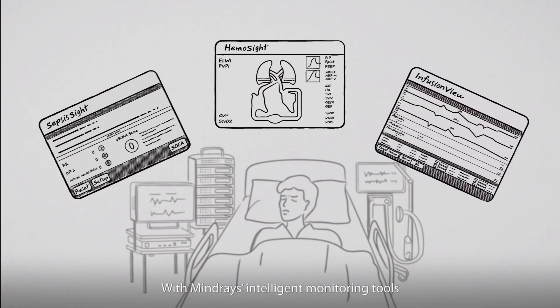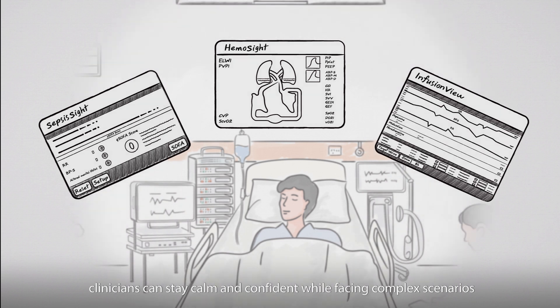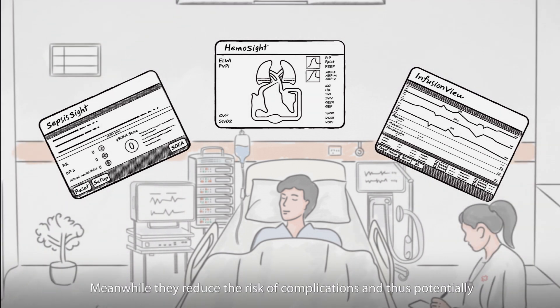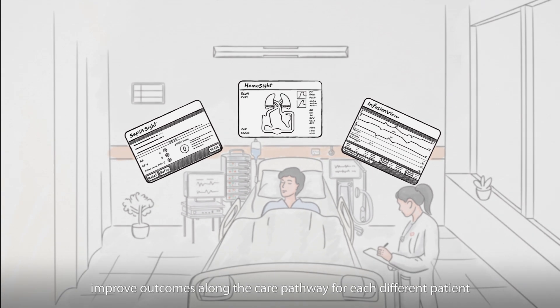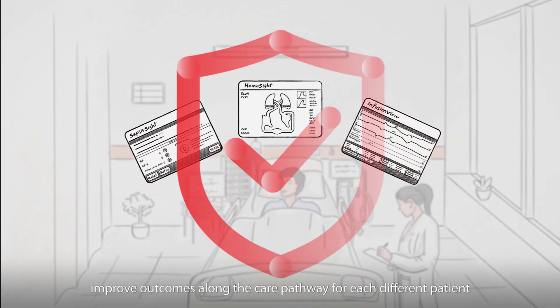With Mindray's intelligent monitoring tools, clinicians can stay calm and confident while facing complex scenarios. Meanwhile, they can reduce the risk of complications and thus potentially improve the outcomes along the care pathway for each different patient.